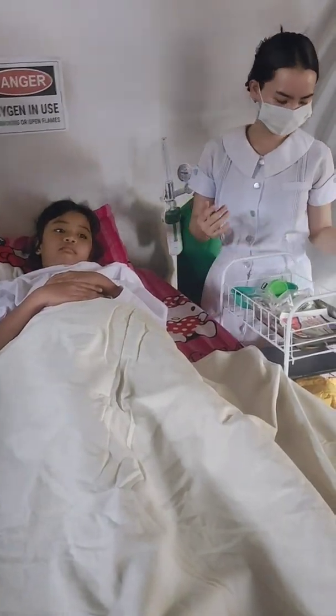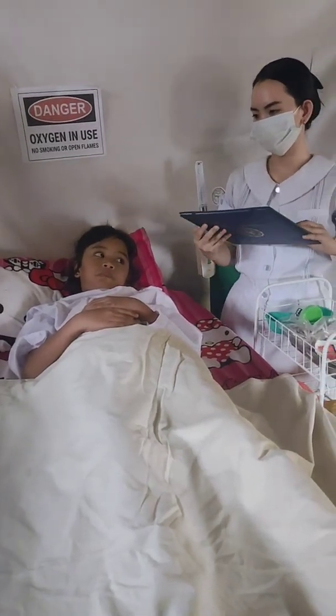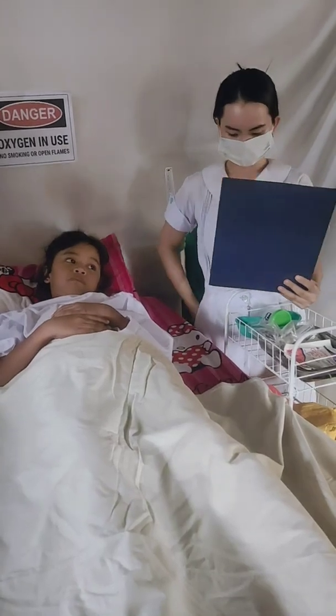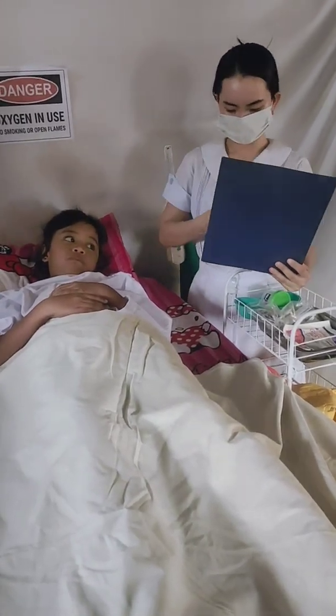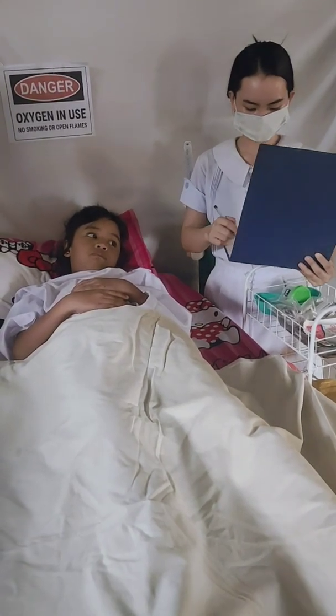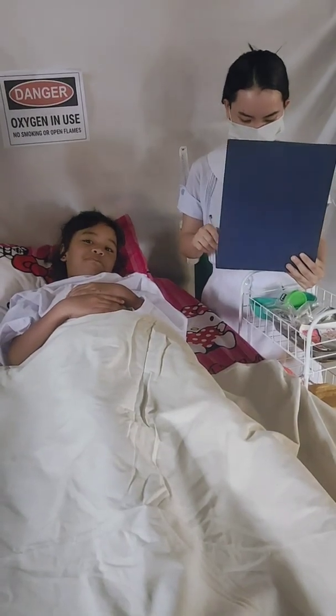Next is review the patient's medical record for the order of oxygen therapy. Note the method of delivery, flow rate, and duration of oxygen. This is to follow the 5 Rs of medication. This will serve as the baseline on oxygen administration. Mode of delivery, nasal cannula. Flow rate, 3 liters per minute.